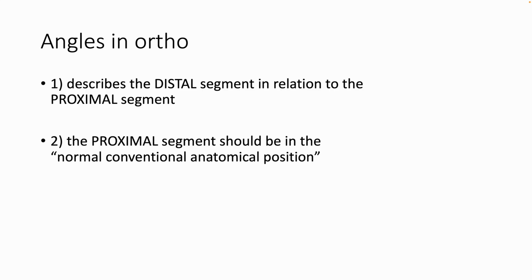It is very important to understand varus and valgus in relation to the knee, not only the relationship between the two bones, but also in terms of description of the joint line and the description of the position of the implants.